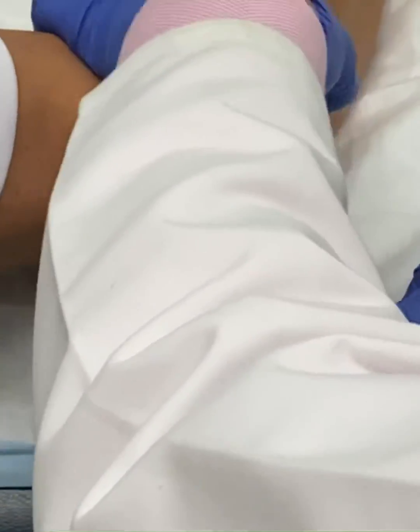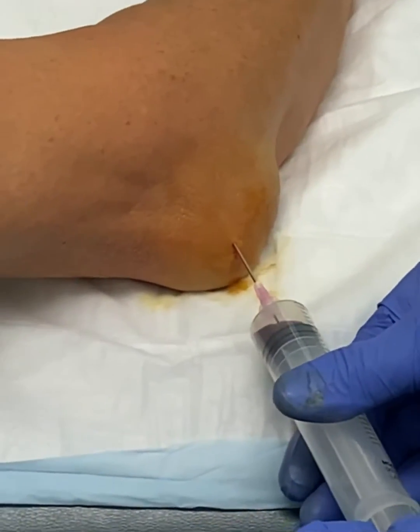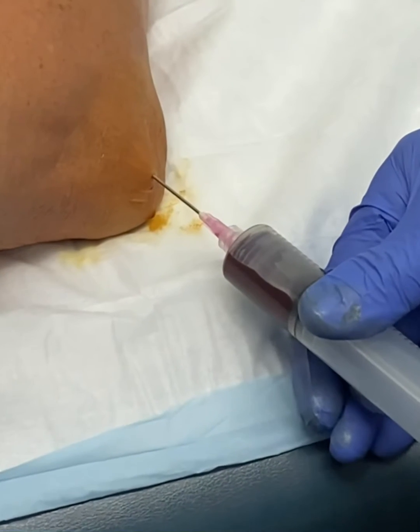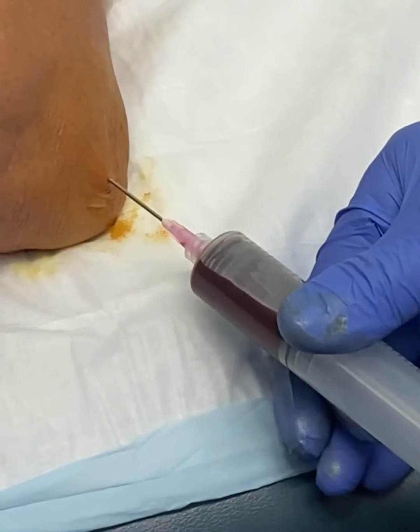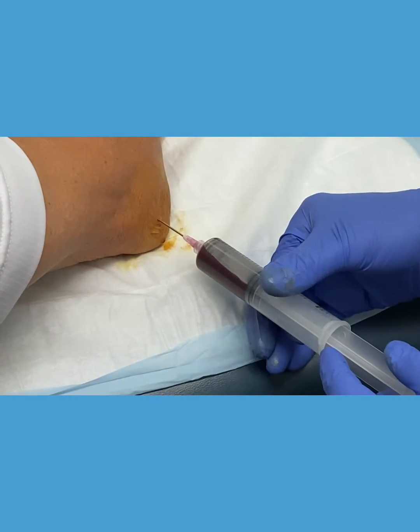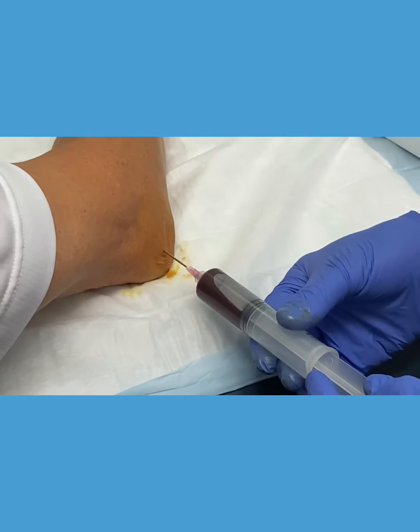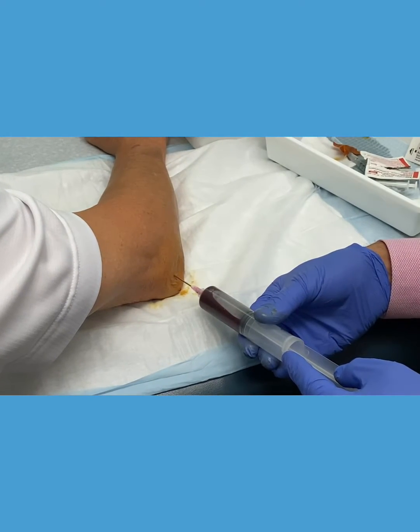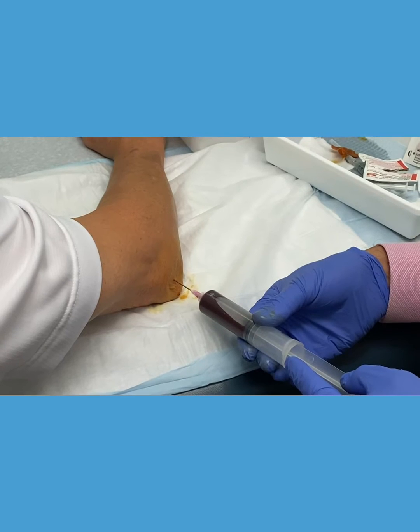Hang in there. You okay so far? I'm fine, thank you so much. And there it is — you can see the blood coming out, as expected. So this was traumatic bursitis. Why am I aspirating? For two reasons: number one, for comfort, and number two, it's not unusual for these bloody bursal collections to become infected.